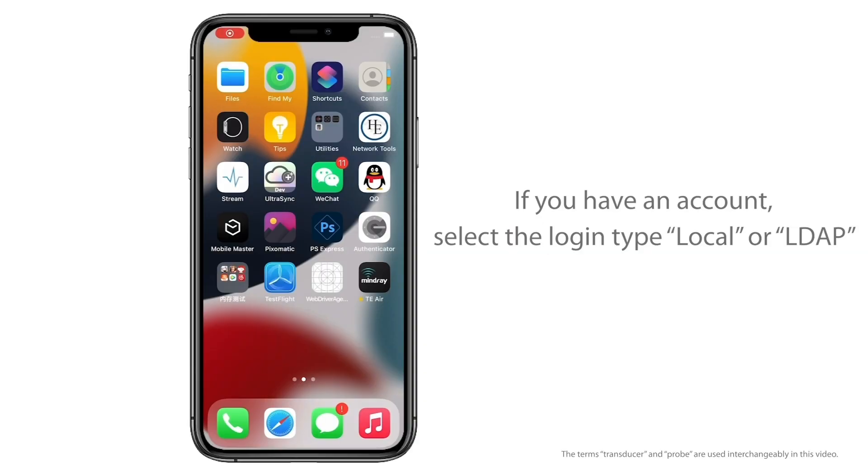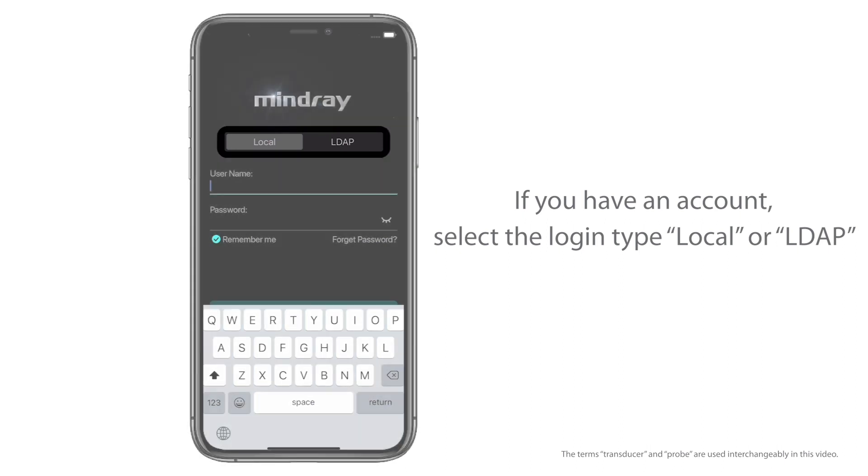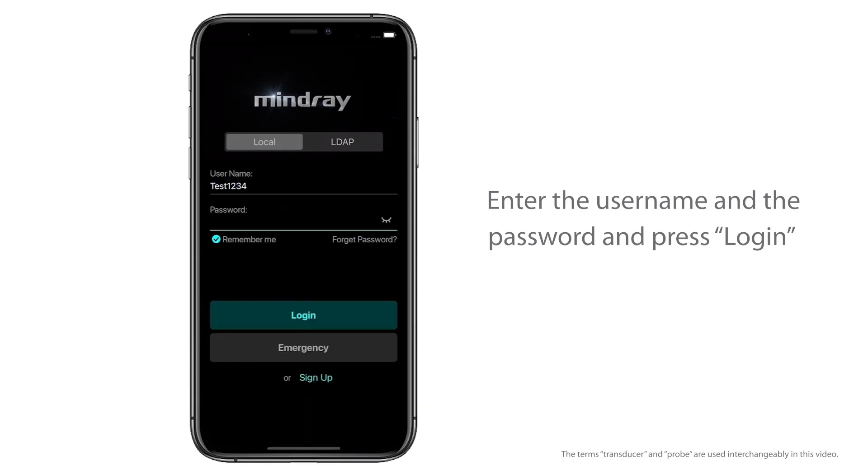Logging onto the system: If you have an account, select Login, then choose Local or LDAP. Enter the username and password and press Login.